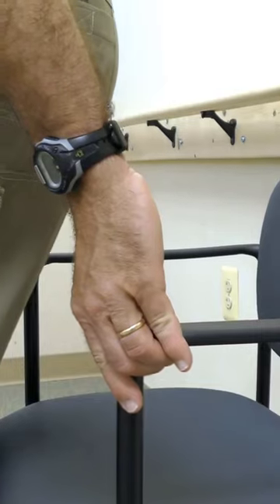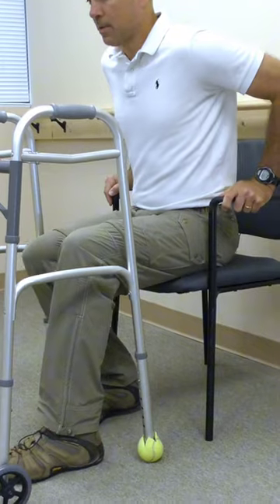Put the involved leg out slightly and reach back for the chair. Always sit in a chair that has an armrest. Sit on the front edge of the chair, then scoot back.